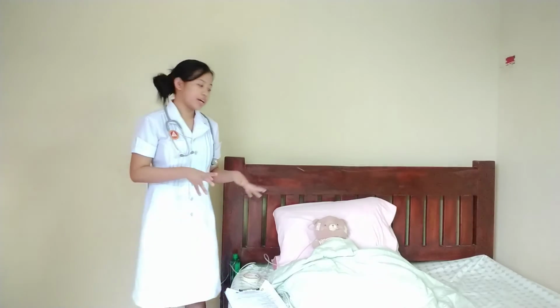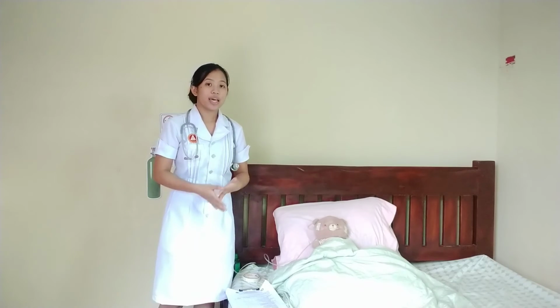We should always remember to assess our client regularly. So we should check the client's nares for any irritation or dryness, and if there is presence of dryness or irritation, we can put on some water-soluble lubricant to moisten and to avoid dryness of the mucous membrane.